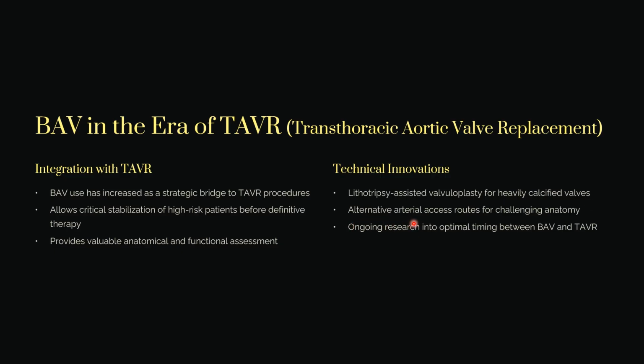Now, alternative arterial access route for challenging anatomy. If there is any anatomical problem, then also it helps. Ongoing research into optimal timing between BAV and TAVR. So between the bridges, how it can be bridged, still research is going on.